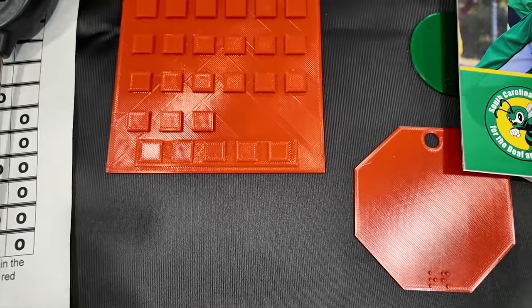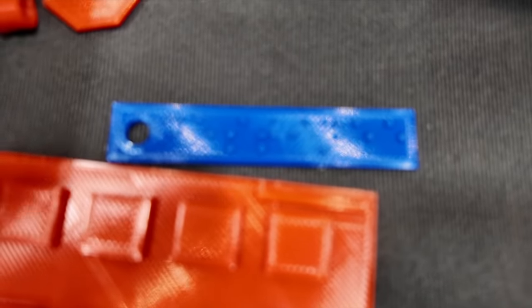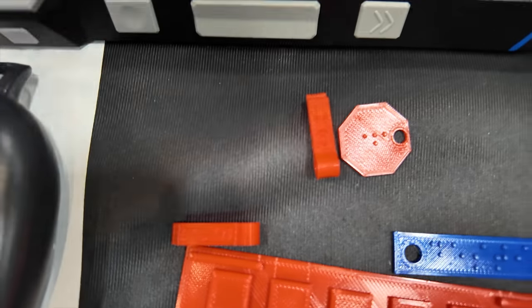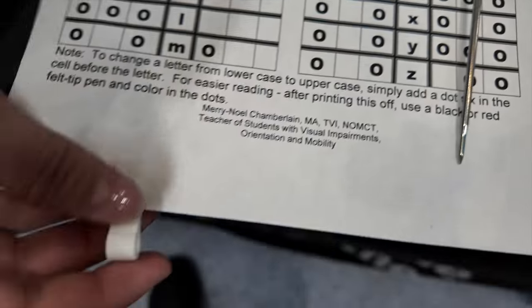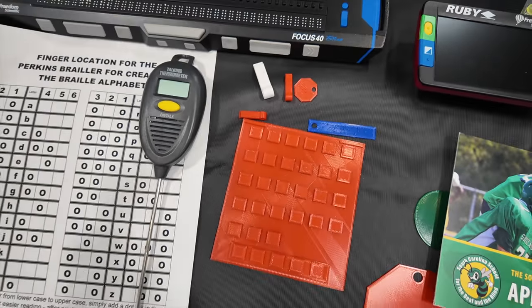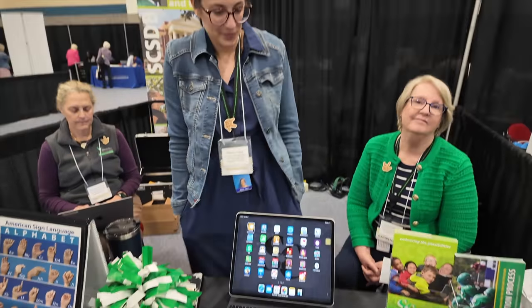We also 3D print name tags for their braille, for their white canes. And we have some money embossers so they can emboss their money and have the currency of their bills on. Just a variety of different items to help make life more usable, user-friendly, and a little bit easier. Marvelous. Well, I certainly appreciate that.